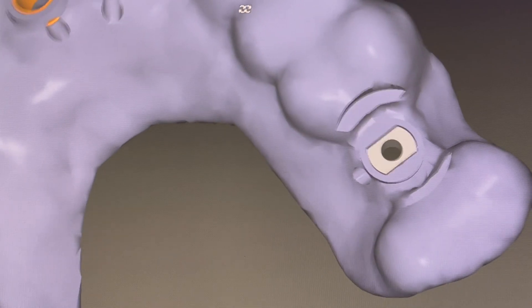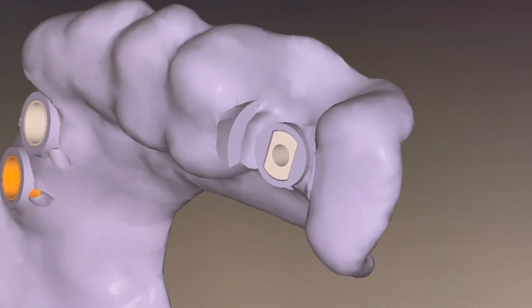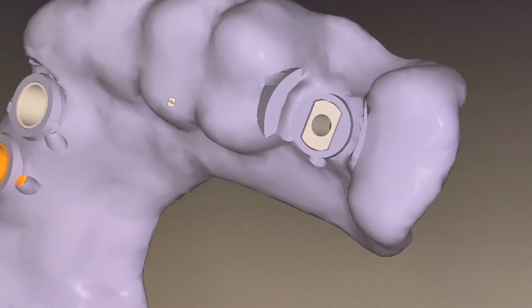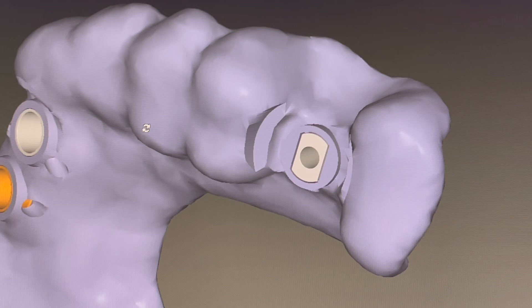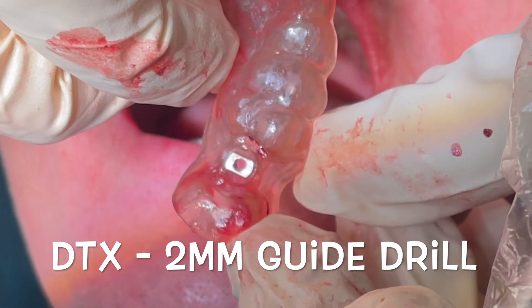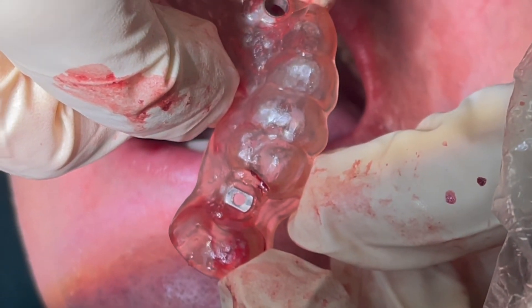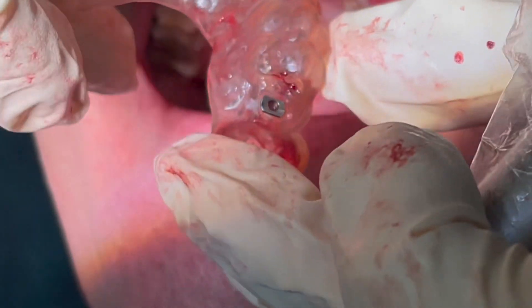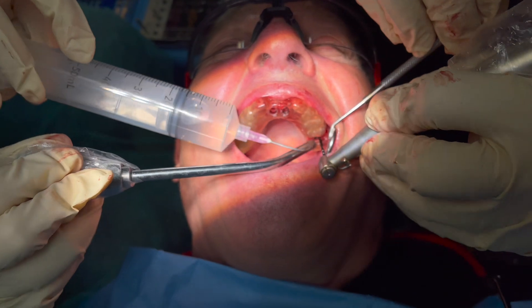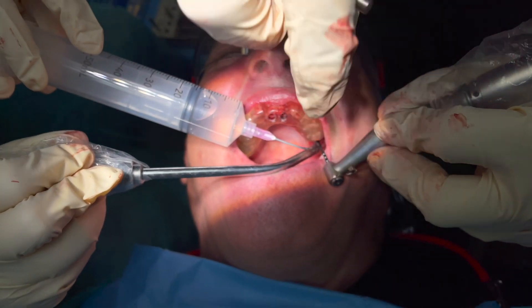Looking at this, we'll make a template to place the implant, so this guide is going to be used with that first drill, which is the two millimeter drill. This is outside of the protocol of the N1 implant, but I like to do this to get the position, the angle, and the depth all marked out from the CBCT software. Then we'll go with the protocol for the N1 implant and go through that with you as we go through this case.